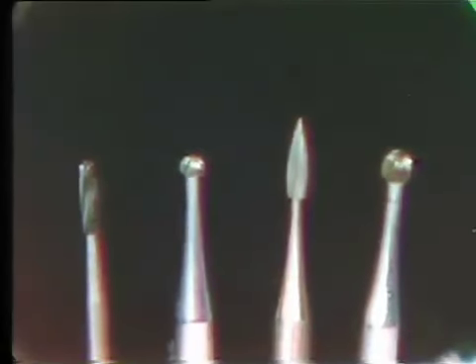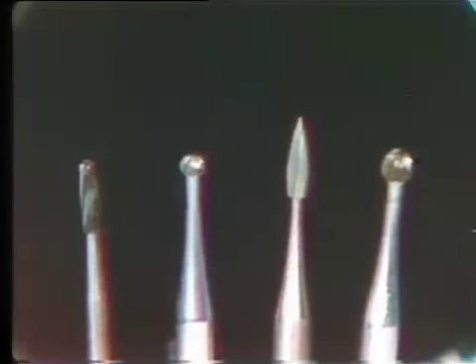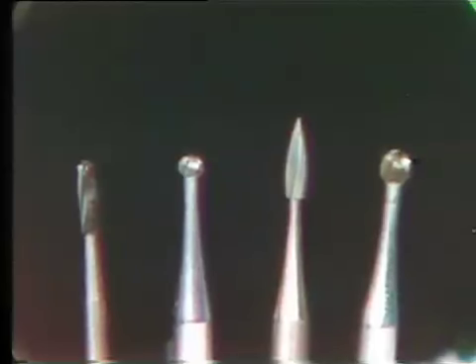So you'll take the straight handpiece flame-shaped burr and measure it about 8 millimeters longer than the regular length flame-shaped latched burr, cut it off with a Joe Dandy disc, and shape it to fit your contra-angle slow-speed handpiece, just as was mentioned in lecture.